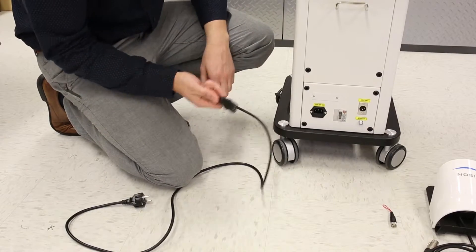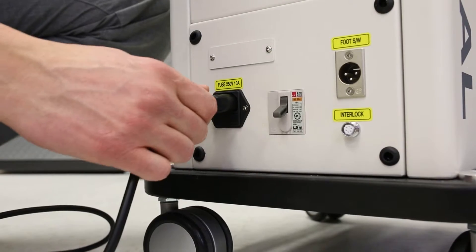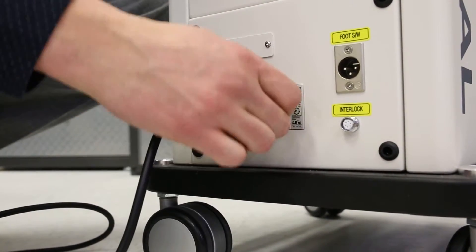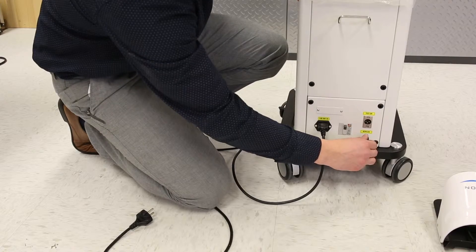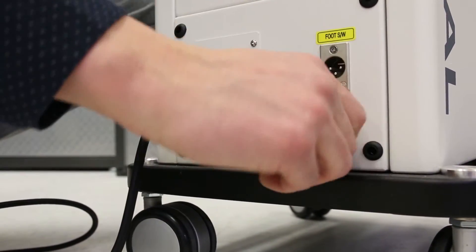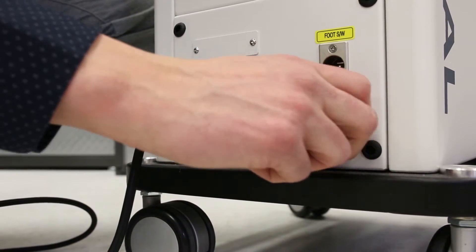Next, this is the power cord. This is going to plug in right here — make sure that this gray switch is on. Next thing you're going to do is plug in this interlock. Rotate that until it clicks in and then tighten the interlock screw just with your fingers.